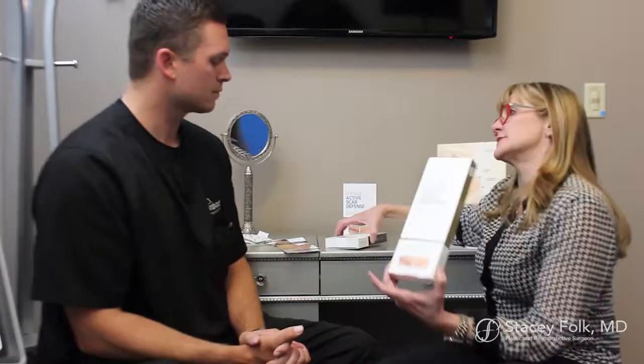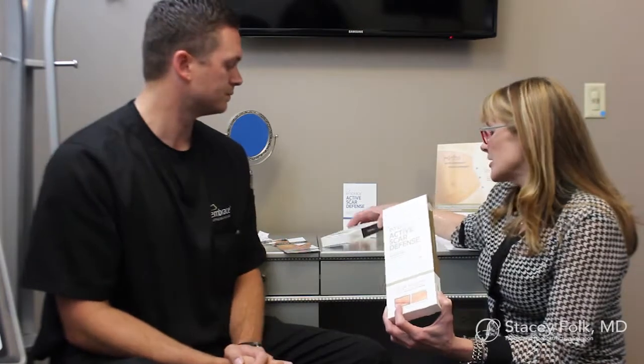So if you have a typical abdominoplasty, that might mean about 5 boxes of this extra large size. Yep, for a tummy tuck, you'd use on average about five large boxes. And if you have a full breast reduction with a full incision on the bottom and one here, that's going to be about 7 boxes. 7 boxes is okay. Correct, yeah. And then inner thighs probably about 7 boxes. Correct. Arms again about maybe 5. 4 to 5? 4 for that.